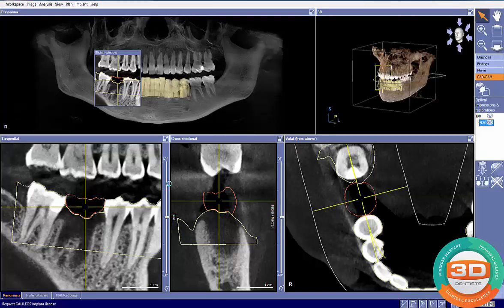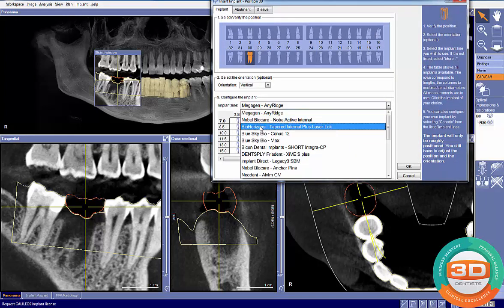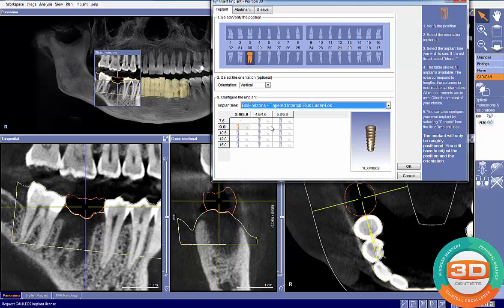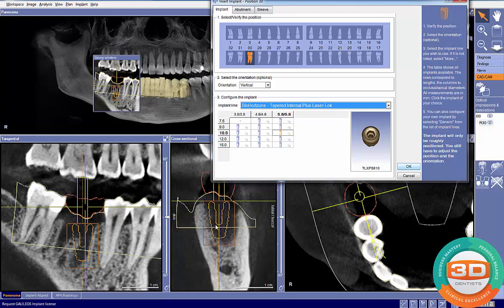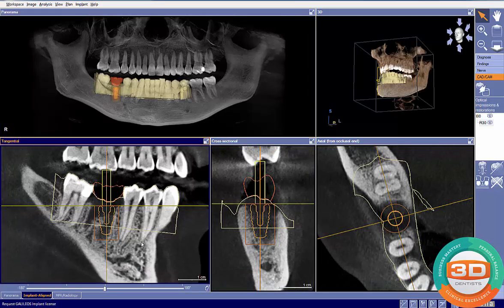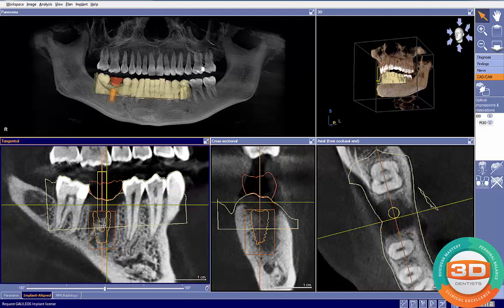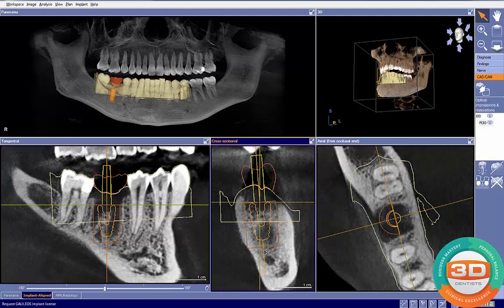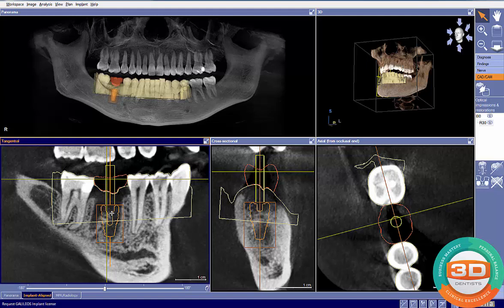Now we should be able to see our proposed restored tooth in this area and what it's going to look like. I'll click the insert implant button and plan out an implant. In this particular case, we're planning a BioHorizons tapered laser lock implant — probably a 5.8 by 10.5. It automatically drops the implant in, then I move to the implant align view and go through the implant planning checklist to get the implant in the optimal spot.